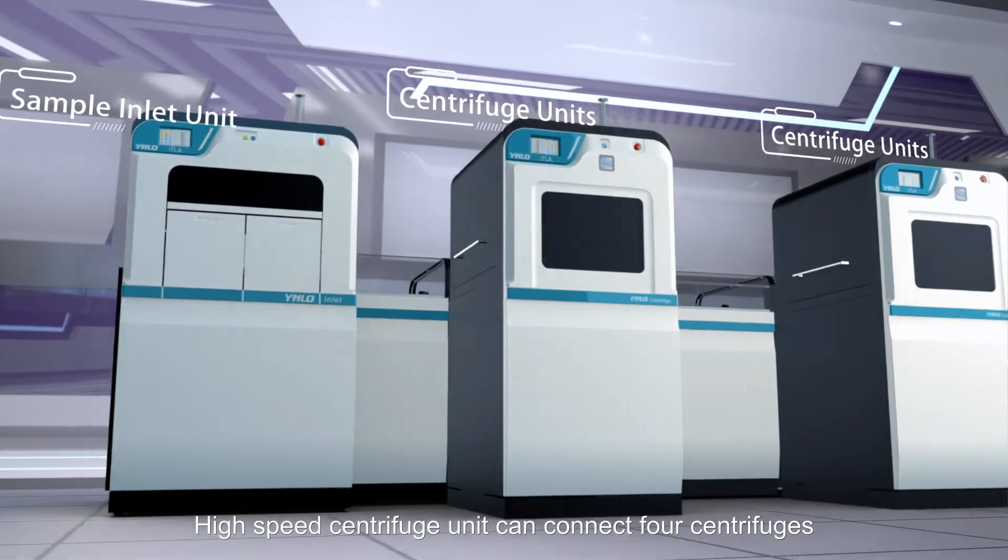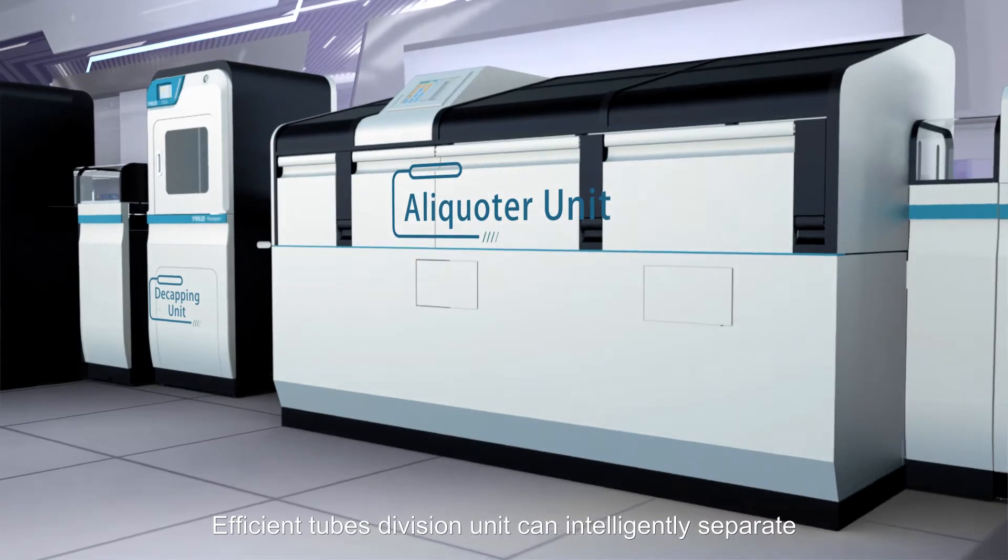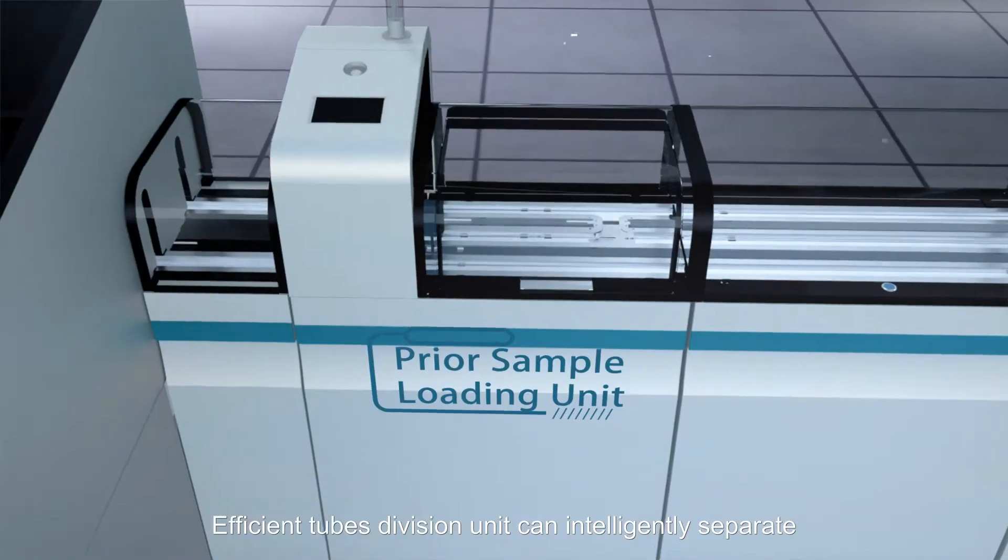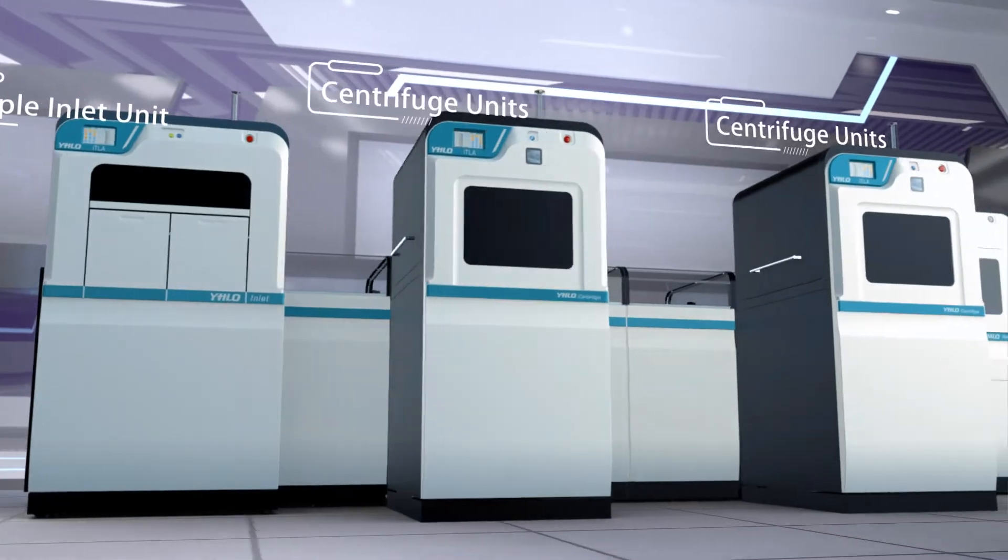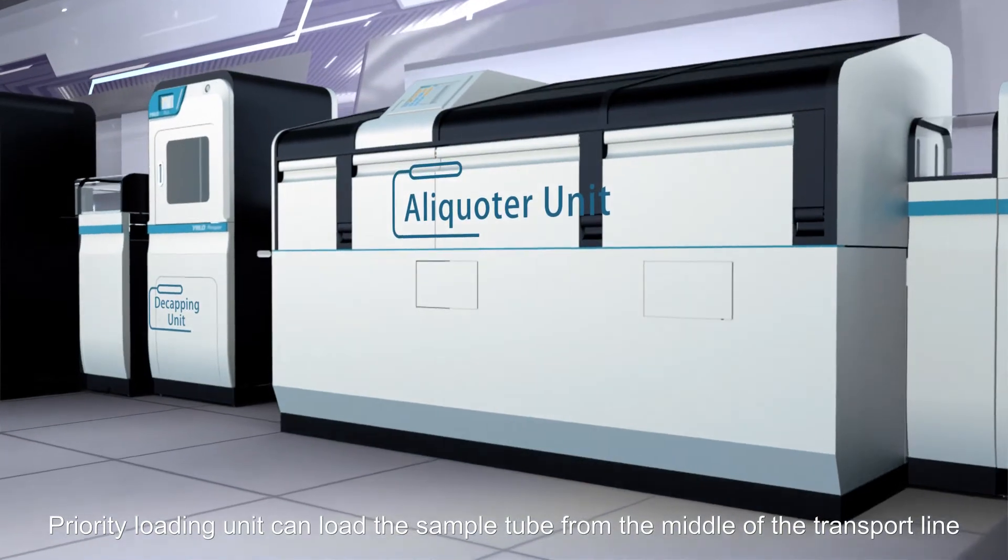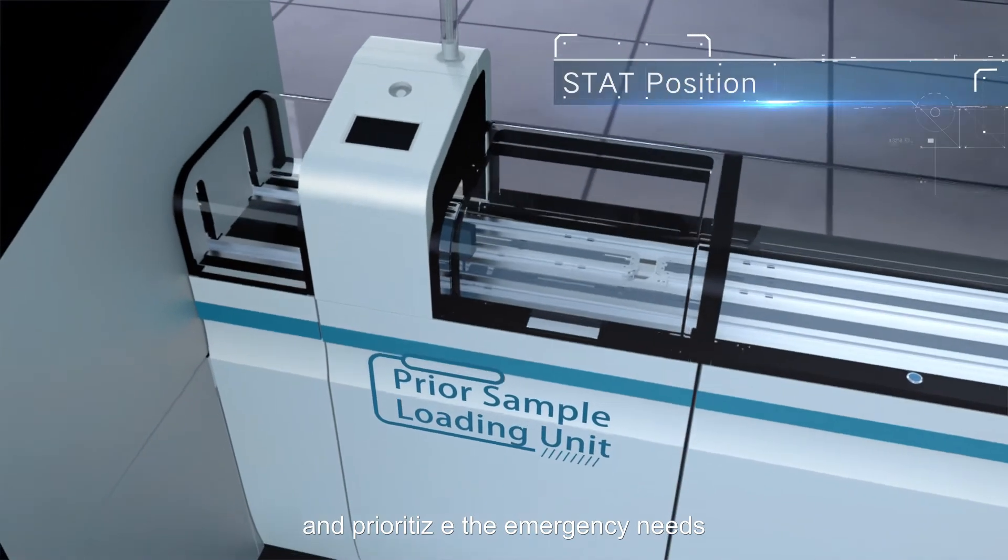High-speed centrifuge unit can connect four centrifuges. Efficient tubes division unit can intelligently separate the tubes and automatically attach barcodes. Priority loading unit can load the sample tube from the middle of the transport line and prioritize emergency needs.